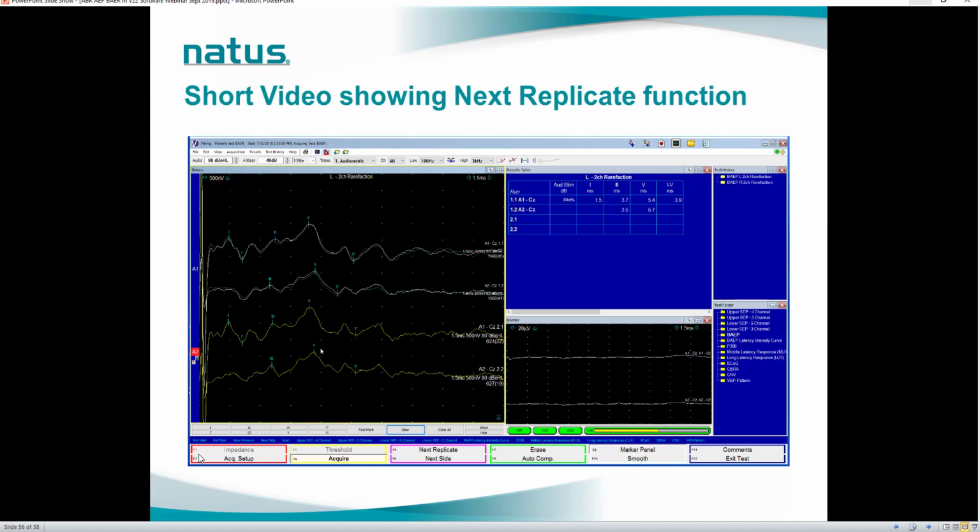Most of the prominent ABR curve has already been formed. We see wave 1, wave 3, and wave 5 very prominently, and the auto markers are being set up. You will see that the markers are placed correctly on each of the waves. So all I need to do later on is just some very fine adjustments.